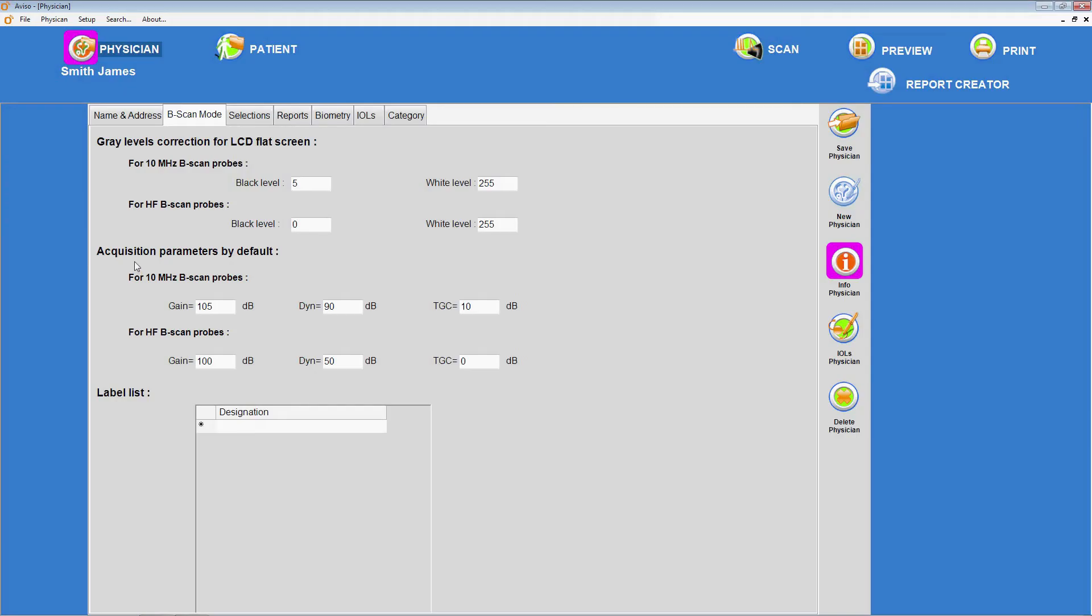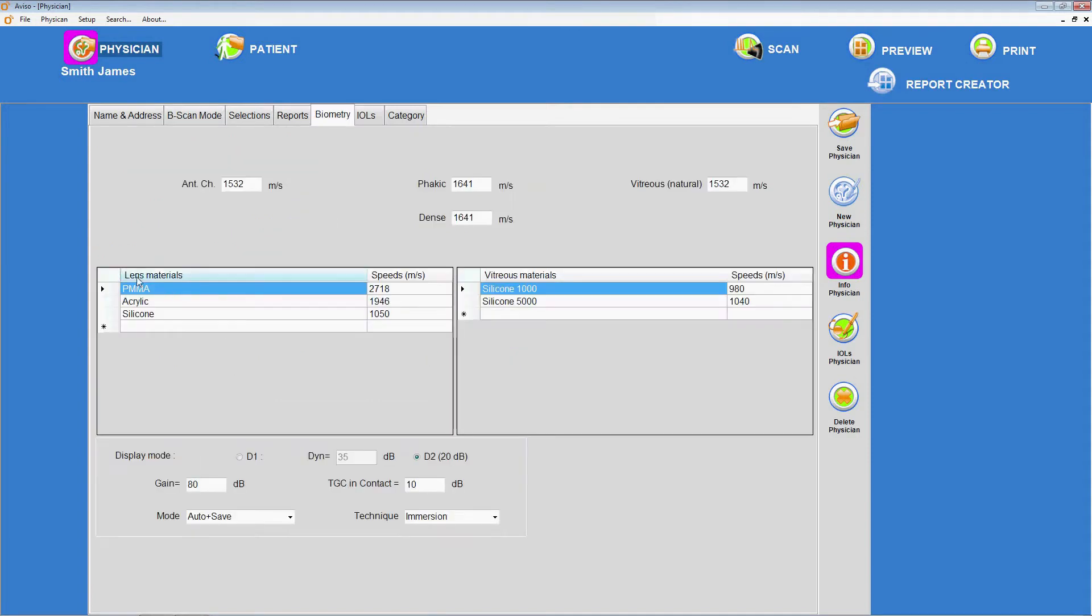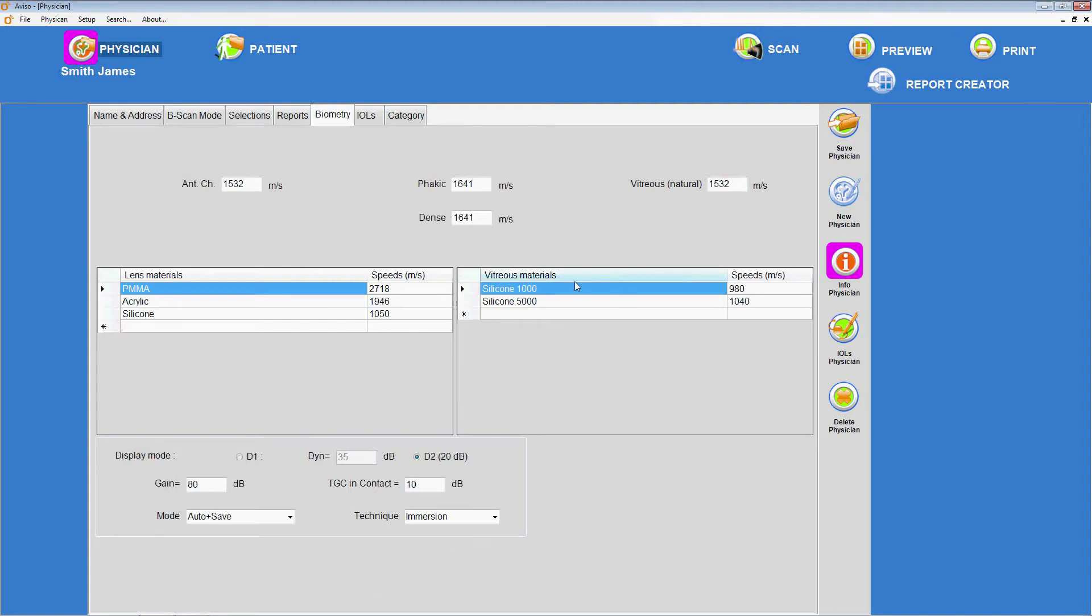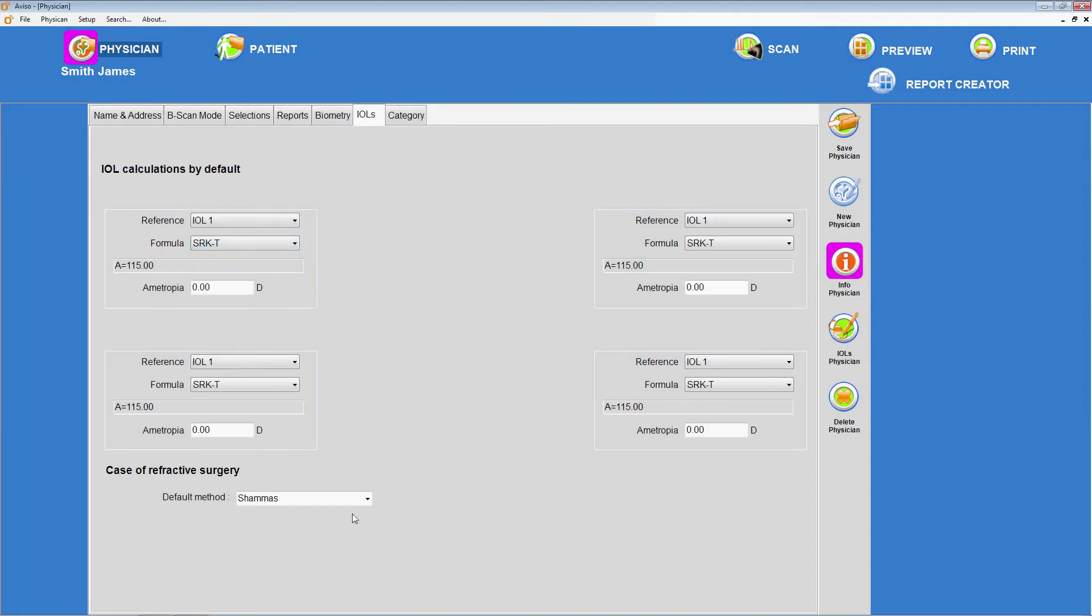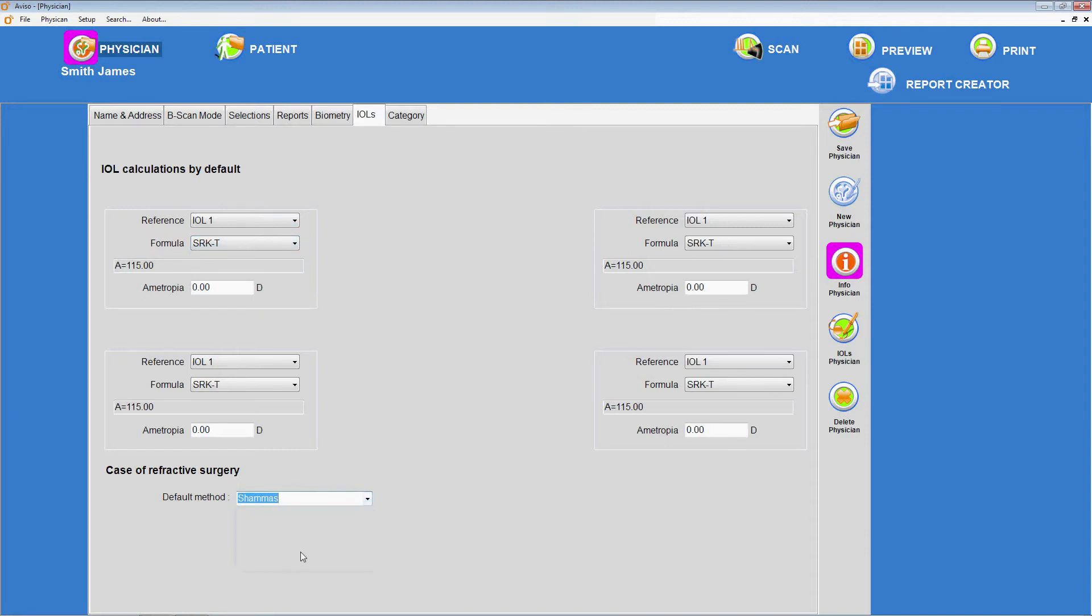For B-scan mode, it is possible to set the physician's preferred gain, dynamic, and time gain control parameters. For biometry, the ultrasound velocities for various tissue types and artificial lens and vitreous materials are set by default, but more can be added. The default gain, dynamic, technique, immersion or contact, and mode, manual or automatic, can also be configured for biometry from this menu. Up to four IOLs can be calculated at a time, and defaults can be specified for the individual physician from the IOL tab on this menu.